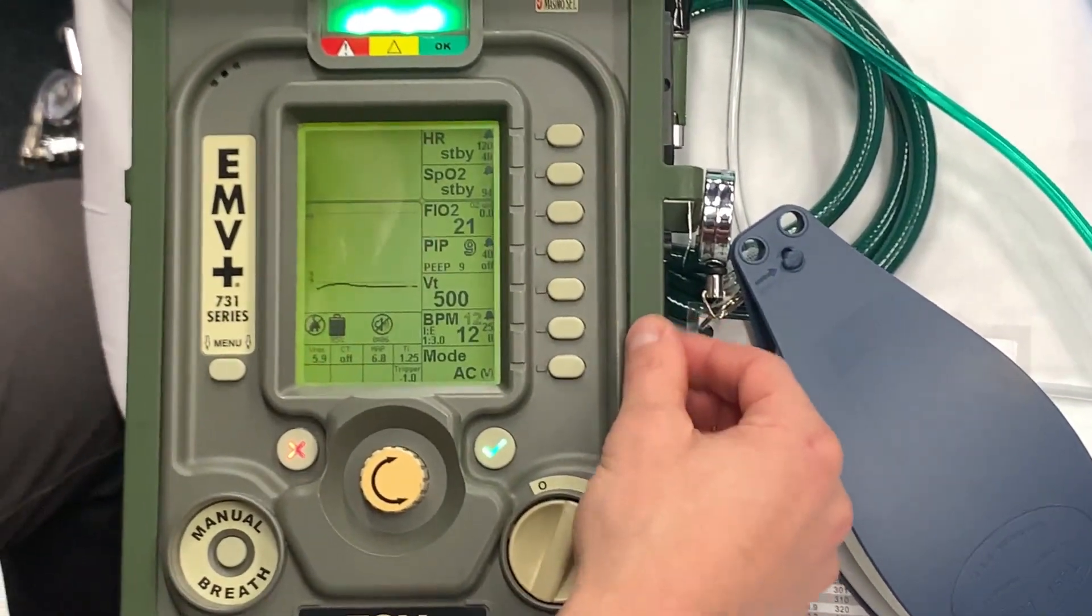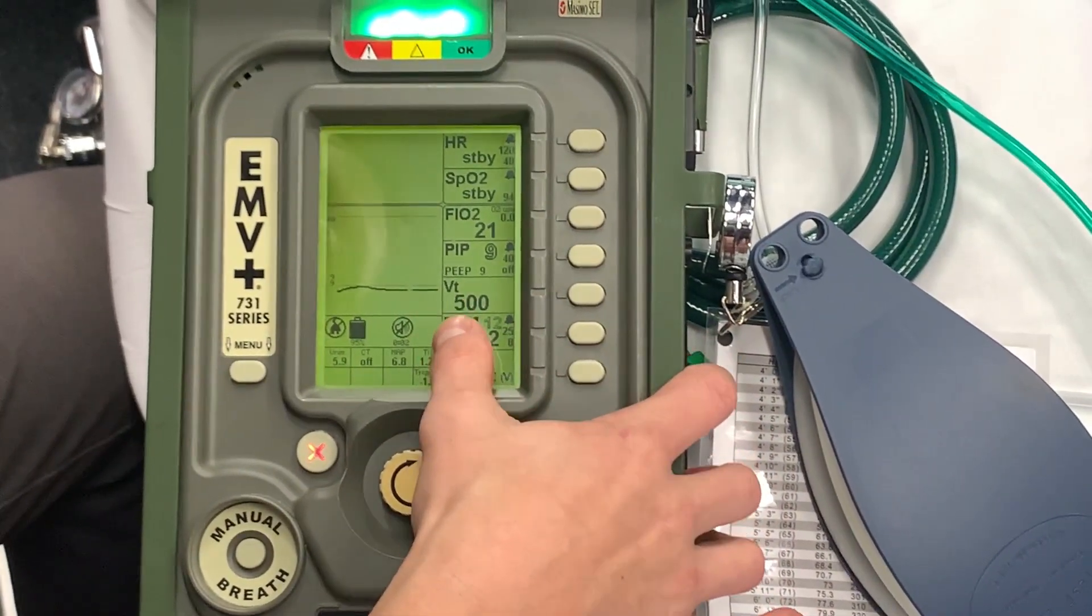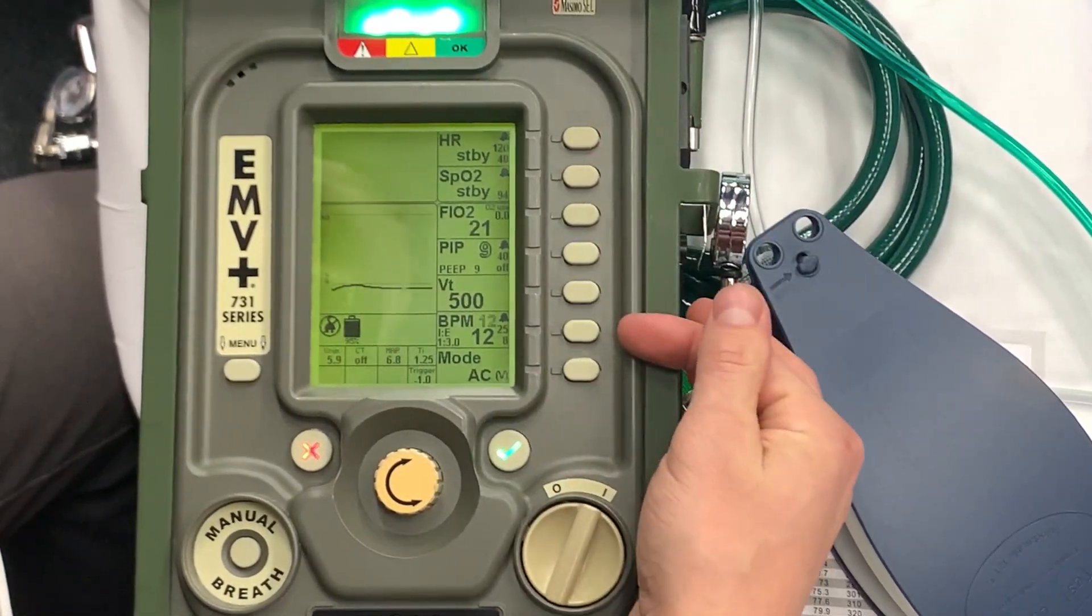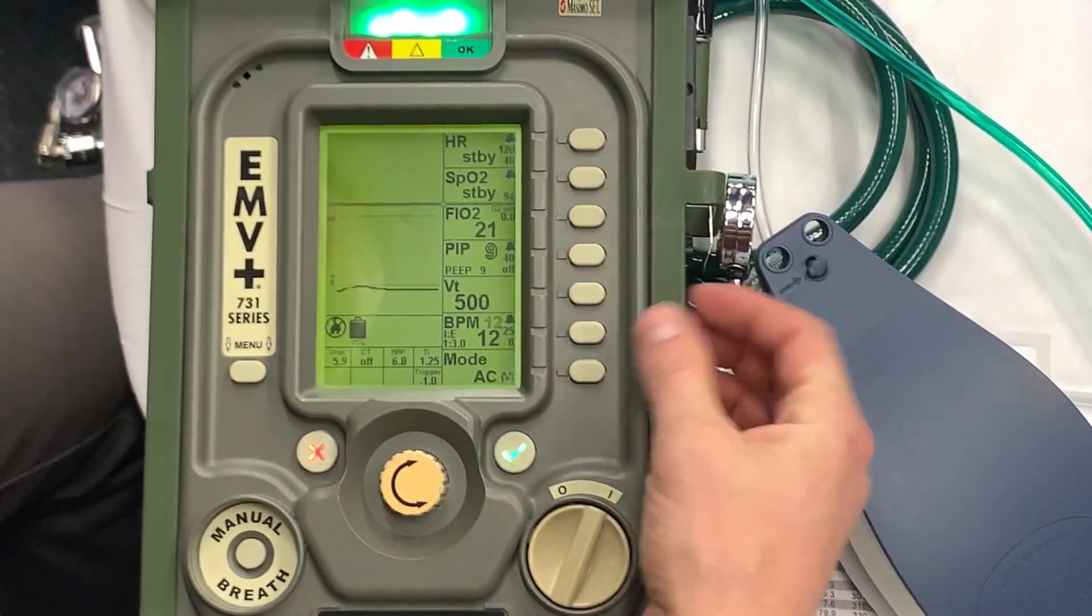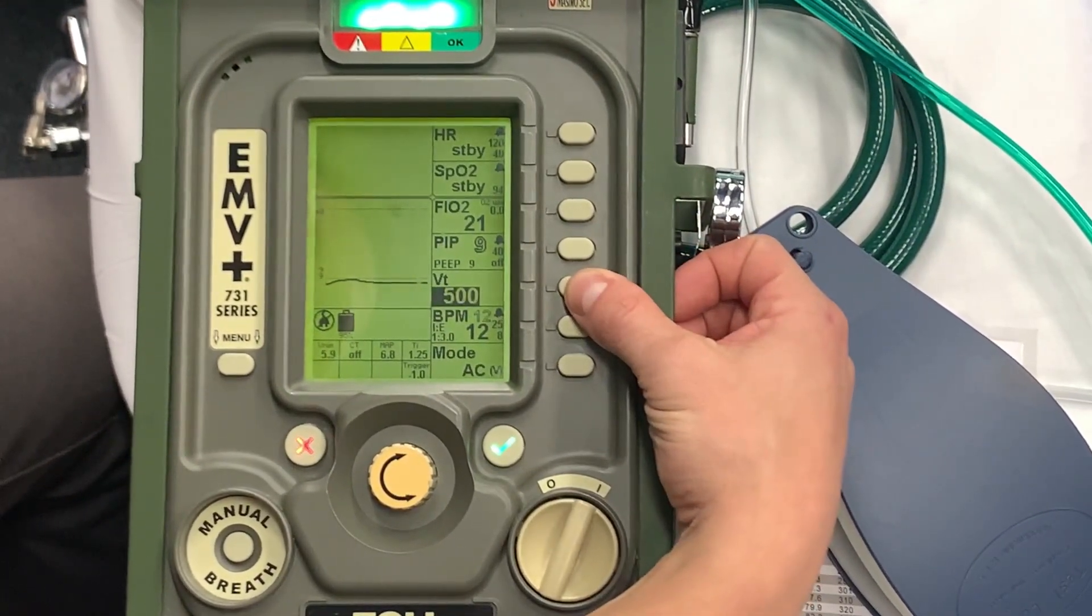So the place that I like to start at is I like to start with my tidal volume. And tidal volume is represented by VT. We can see that right there. If I want to choose any of these topics, we've got several soft keys next to here. The given choice is right to the right here. So if I want to change my tidal volume, press my soft key, it highlights.